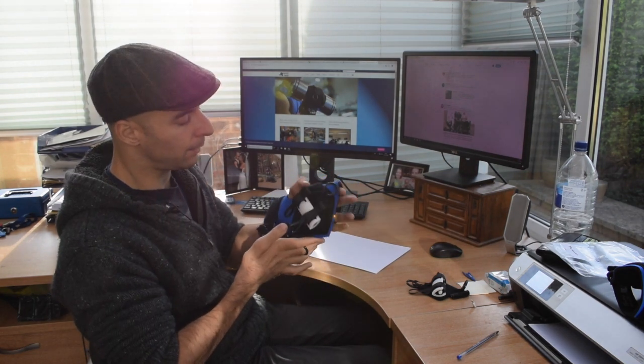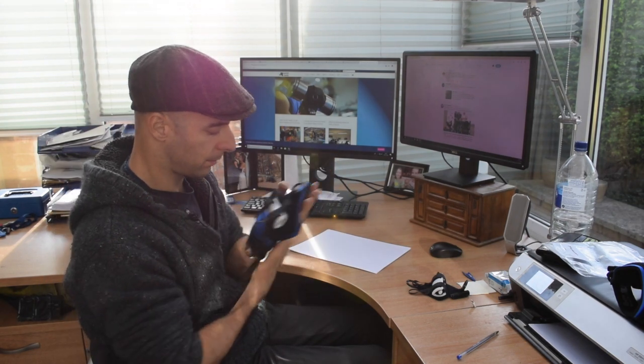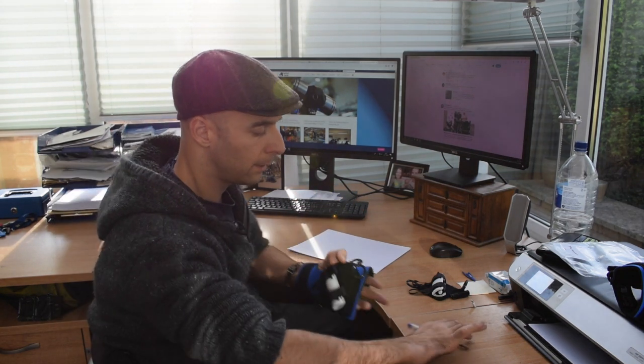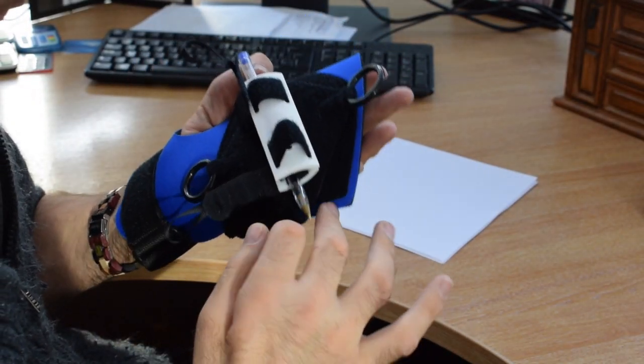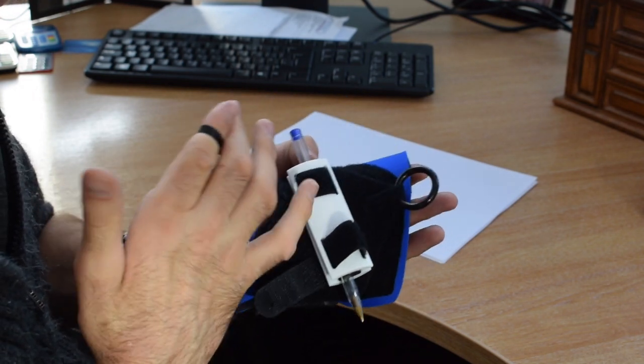So this is how it works. Put it on your hand with your thumb sticking out and fasten these two straps. Then there's a small clamp in the hand here — you can prise it open and put in the item you want to grip. So on this occasion I'm gripping a pen. Use these finger straps to tighten it up.